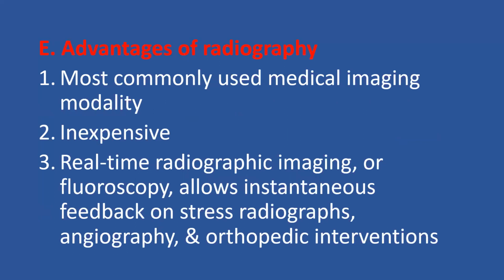What are the advantages? They are most commonly used medical imaging throughout the world. First of all, it's cheap. It is inexpensive. And real-time radiographic imaging or fluoroscopy allows instantaneous feedback on stress radiographs, angiography, and orthopedic interventions. If you're doing a closed reduction, you need fluoroscopy to confirm your fracture is reduced. So you see, we use it in every day's work program. So keep this in mind.